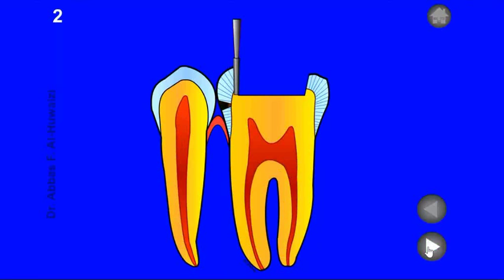Step 2: Deepen the cavity at this point to include the carious area.